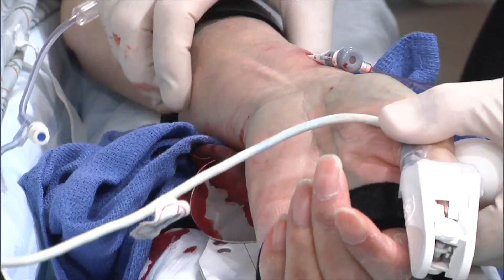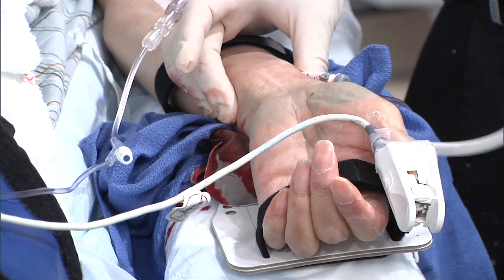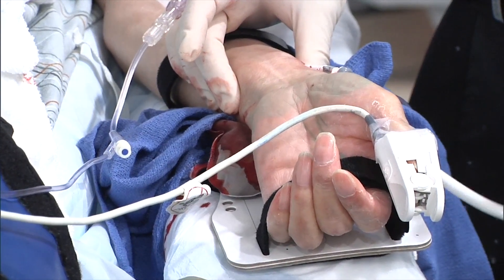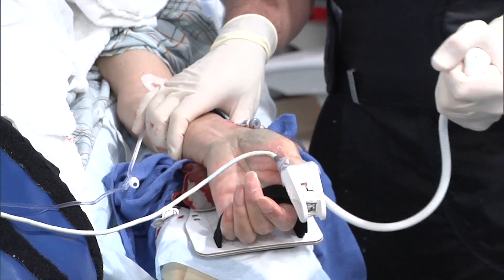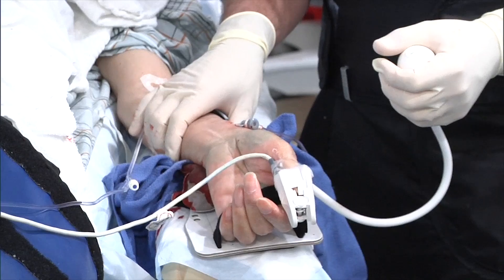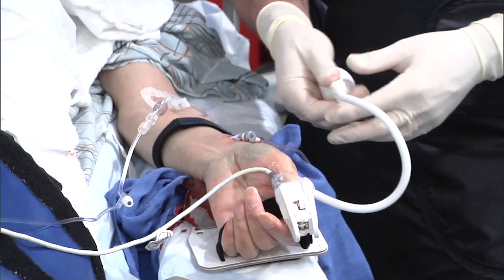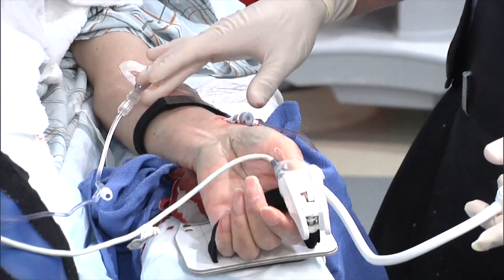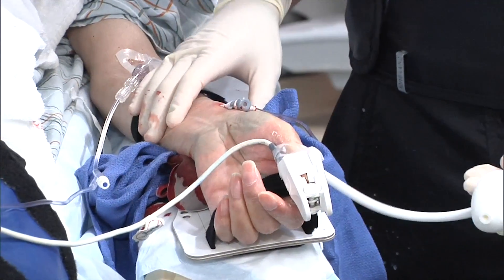Essentially what this is, is a positioning band, but it has a little pillow underneath that you can inflate with a blood pressure cuff. And so it actually will sort of externally rotate and position the arm so it's easier to access. You can release it with this little button. The next generation of this device is going to also have a closure band built in, but we can talk about that later.